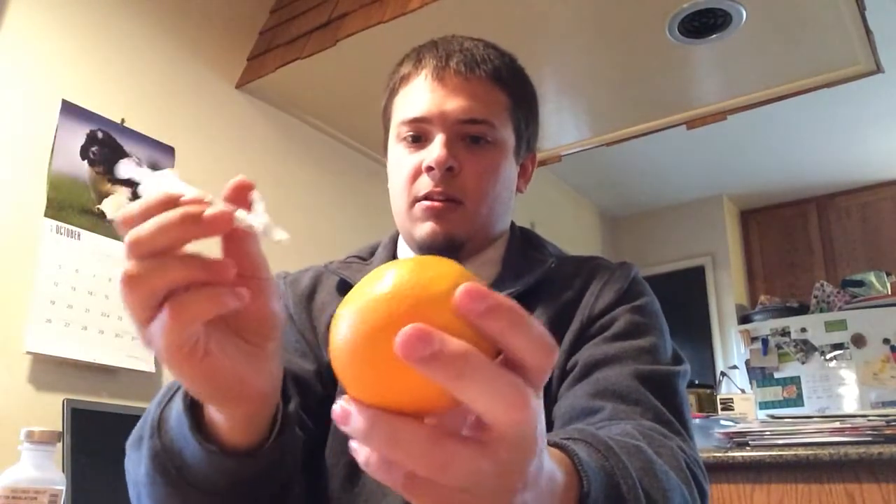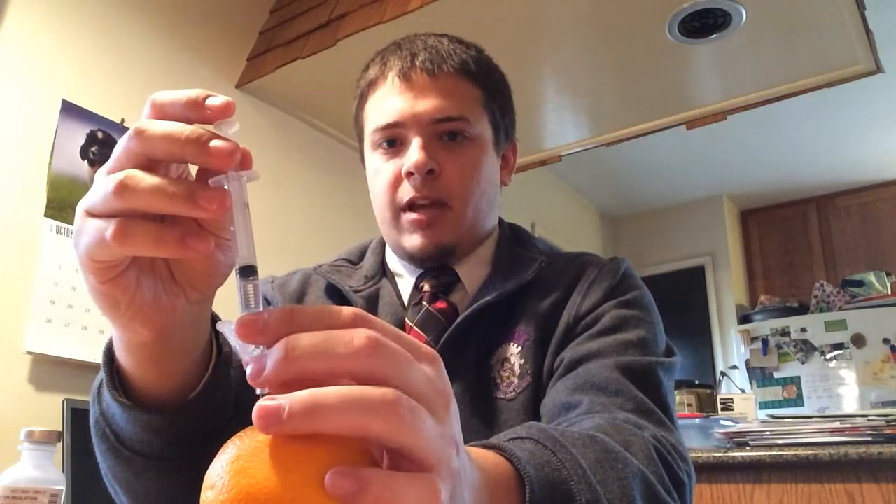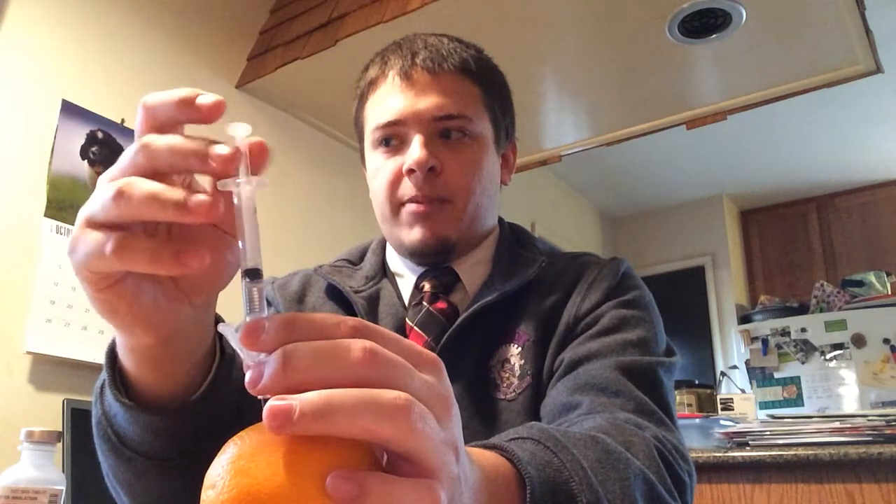You want to take another alcohol swab, swab off the area starting in a circular motion and going outwards. Then you take the needle and put it in at a 90-degree angle. Before you inject the drug, you want to aspirate and make sure that there's no blood return, because you don't want to inject a drug into somebody's blood vessel, as that can cause a whole other mess of problems.